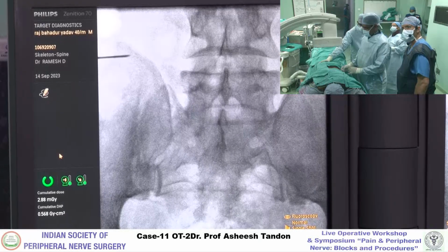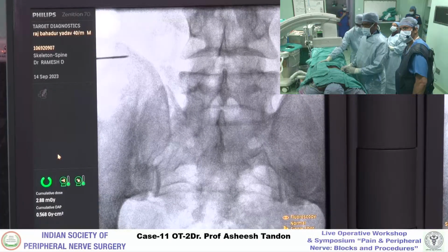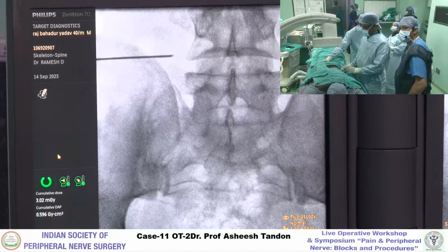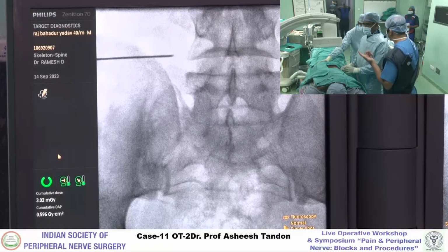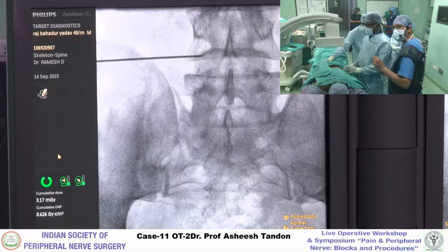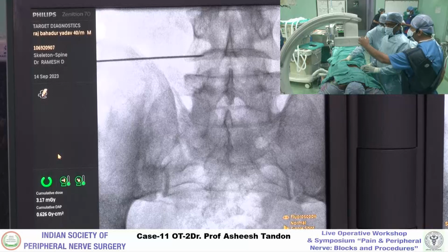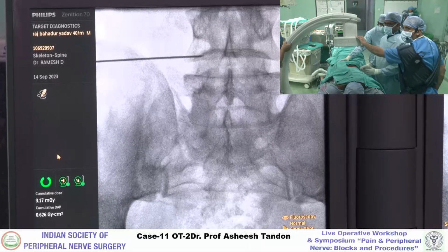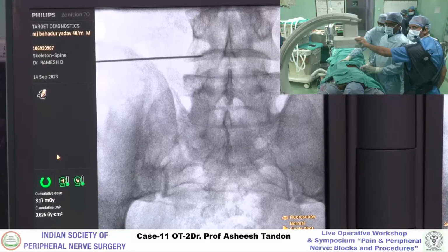Yes, go ahead, shoot, good. You'll feel some resistance when you're entering the foramen, or you'll feel bone. Shoot please. No, you've gone too much. And adjust this parallax a little, straighten it a bit. Yes, that's enough, shoot.